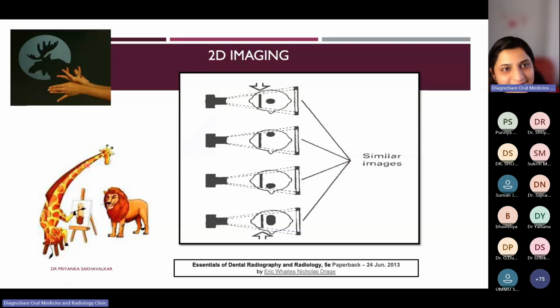Similarly, when we are discussing 2D imaging or 2D radiology, what I would like to call shadowlogy, the shadows we observe can be just as deceptive as we saw in the previous example. If two structures are close together, they may appear as one single shadow.